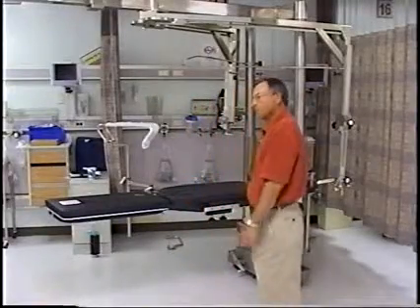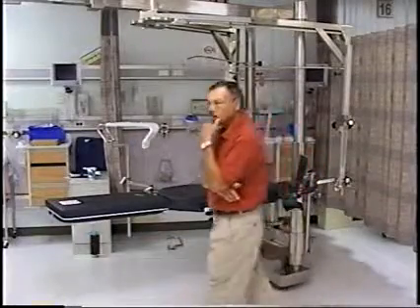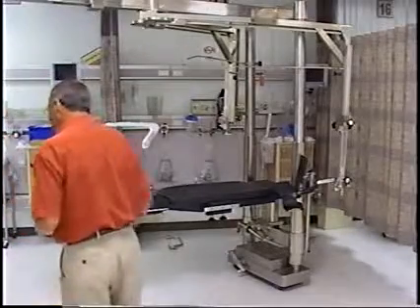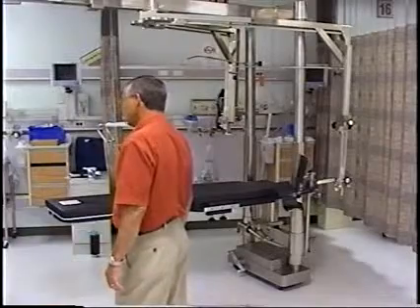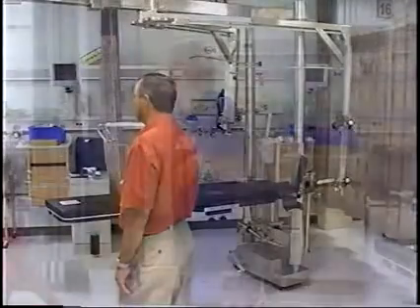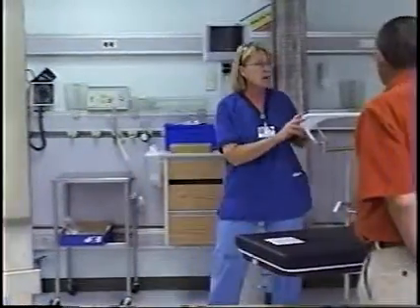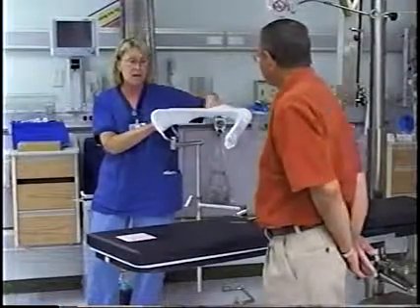On the nursing side, we usually keep soft roll. Usually, when I set a table up, I'll put a couple of rolls of soft roll down here, and then a couple of our ACE wraps. That way the doctor can just see it, and maybe an ABD, the doctor can grab it right here on the base, and they can go ahead and start padding up the foot. Right. And then usually the ACE wrap is used right here to secure this on this cradle area.